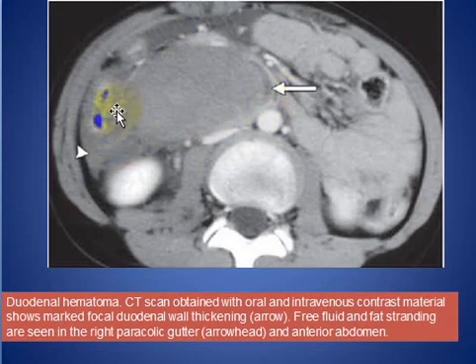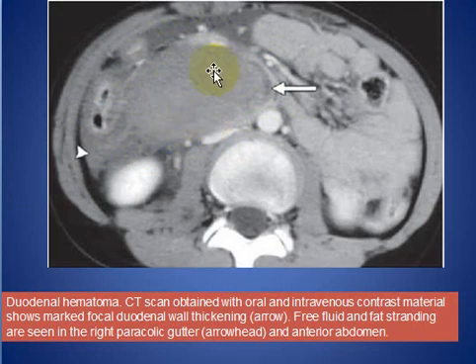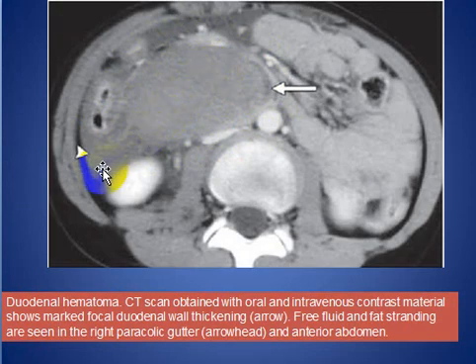Here we have a patient with duodenal hematoma. The CT scan is obtained after oral and IV contrast, and we see marked thickening of the duodenal wall with some free fluid and stranding.